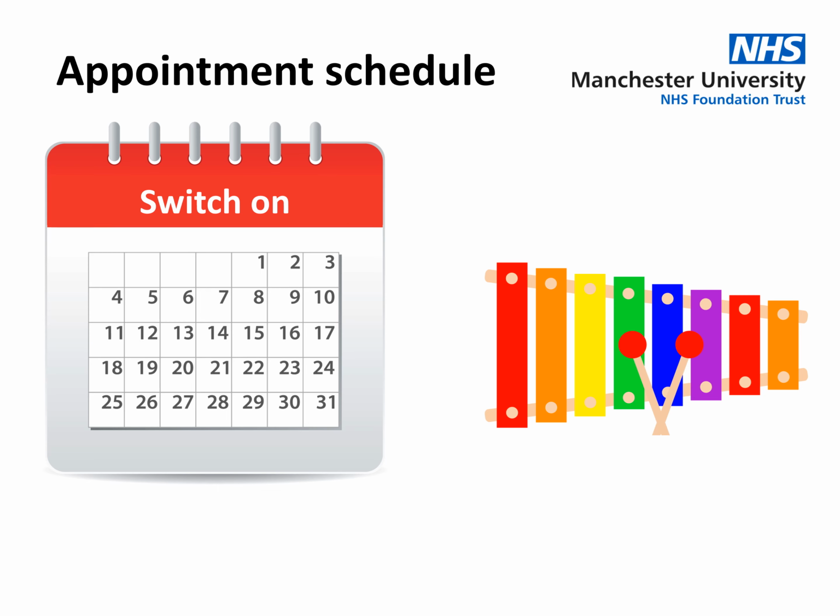You may be able to recognise speech, but most people will still need to lip read when listening to conversation at first. In the early days, it's really important to wear the cochlear implant as much as possible, as this is the best way to get used to it. We know that the more you practice listening with the cochlear implant, the more natural the sound quality will become over time. This can take several weeks or even months.